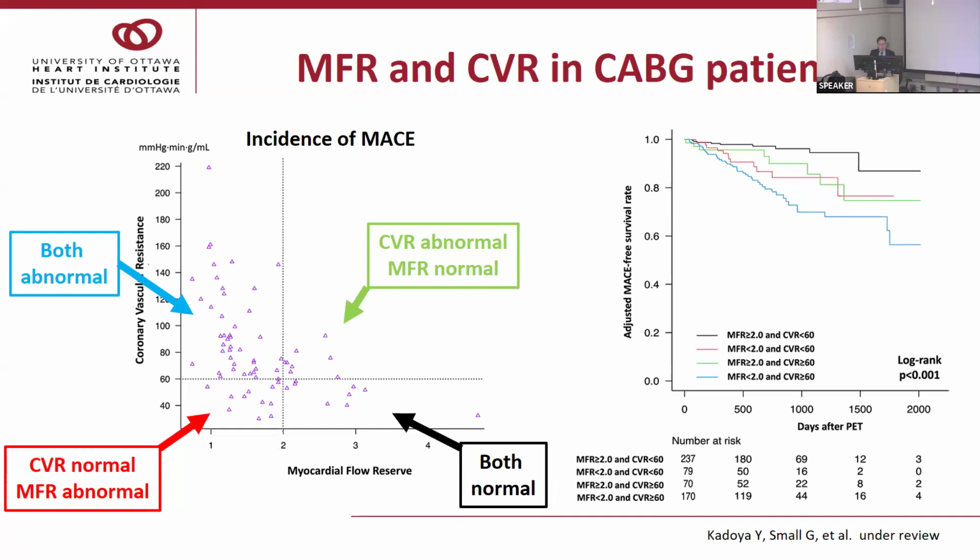And moreover, multivariable analysis confirmed that both CVR and MFR were independent prognostic predictors of MACE. So based on these findings, we believe that incorporating both MFR and CVR improves the prognostic value of PET.